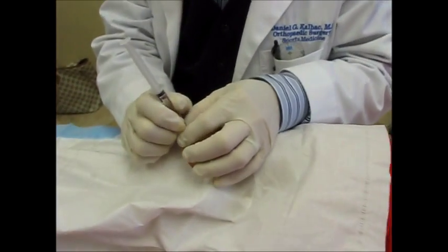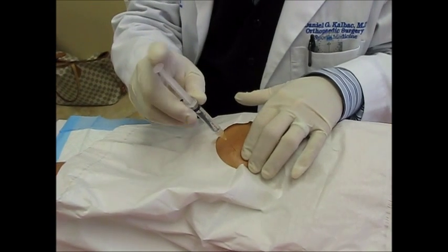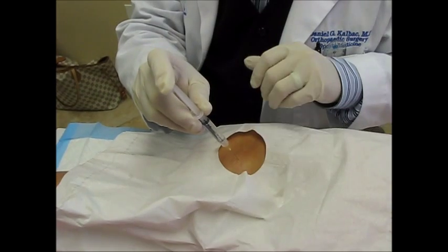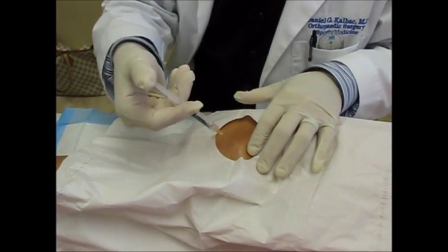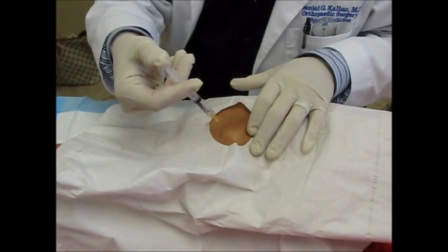I localize the spot and go right through the skin — just a little pinch, nothing. Then I numb it up first with lidocaine, going all the way down and all around so she's numb all the way around, because I'm going to inject the plasma right into the ligament. The lidocaine is the worst part.